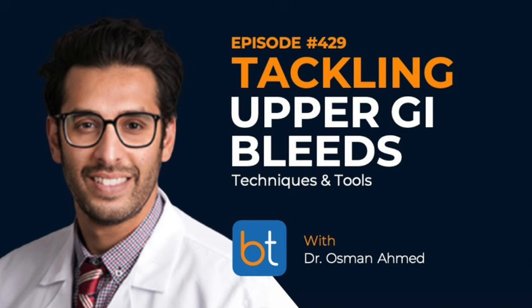And then microcatheter, is there something that you really like? We won't hold you to it, but for us, it's always a ProGreat that's available, though there's a variety of different microcatheters out there. Some really have advantages, but ProGreat tends to be what works best in my practice. Yeah, 100%. ProGreat for me is a workhorse microcatheter, a really nice catheter from Terumo.